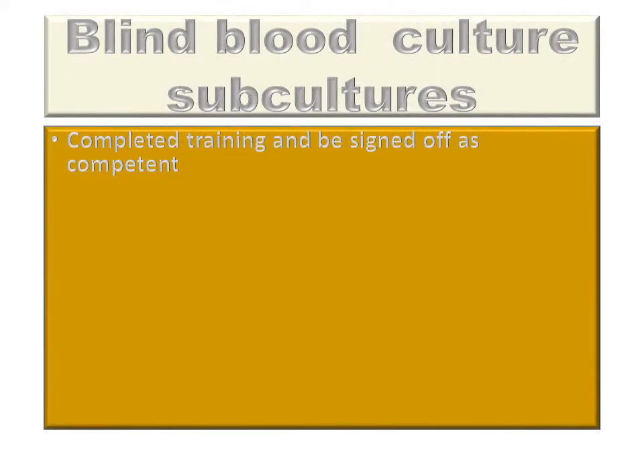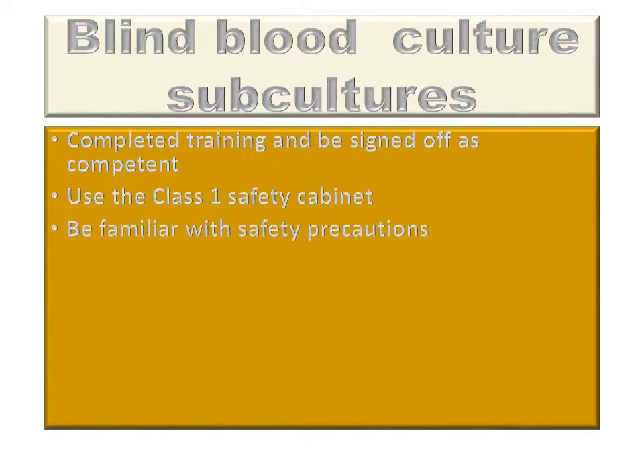All staff undertaking the test must have completed training and be signed off as competent. All the work must be undertaken within the Class 1 safety cabinet and staff must be familiar with safety precautions.